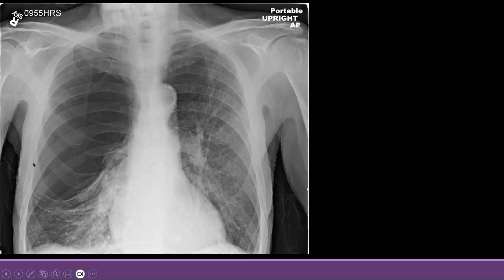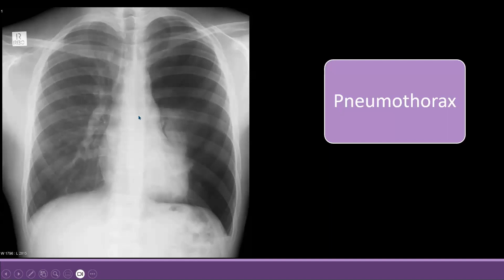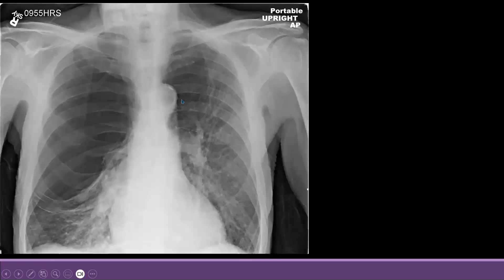A bulla appears as a rounded area of hyperlucency. The key differentiating feature: in pneumothorax, the border of the collapsed lung is convex, while in a bulla, the border is concave. Convex border means pneumothorax; concave border means bulla.